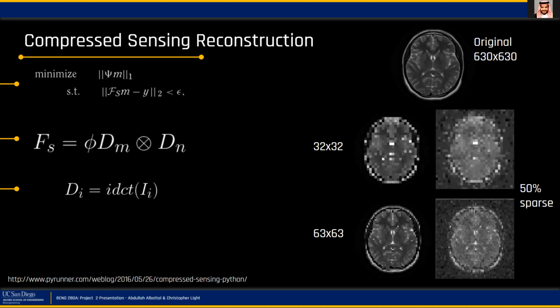So what we see is we had to downsample to 5% and 10%, and following this process, we used half of the k-space data, and the reconstruction is shown on the right. They are not great, obviously, because they're very small and pixelated, and this points out the smaller your pixel space, the less compressible your images are.